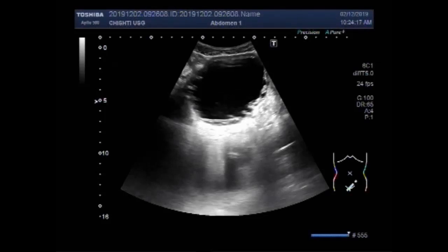Dear viewers, I hope you are all fine. This ultrasound video shows a trabeculated urinary bladder.